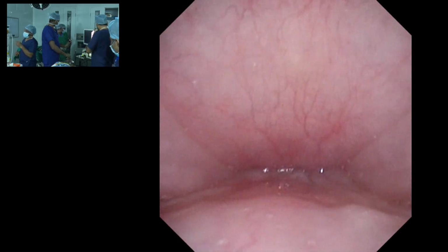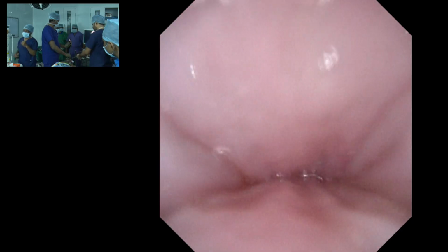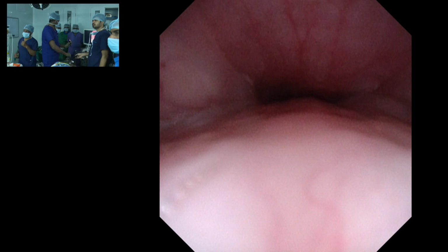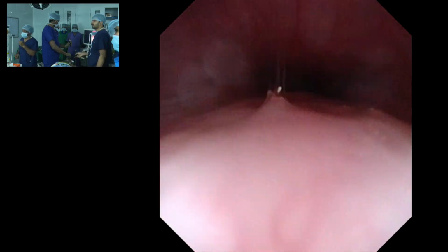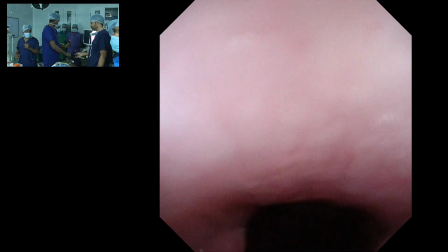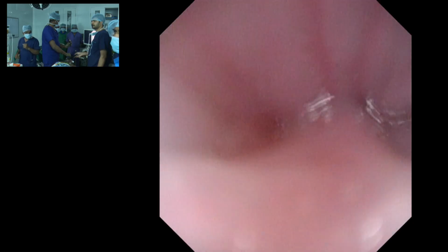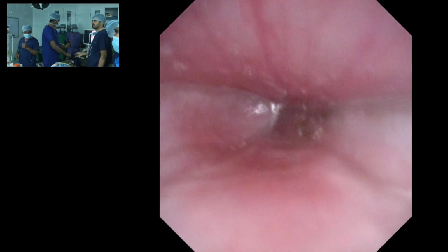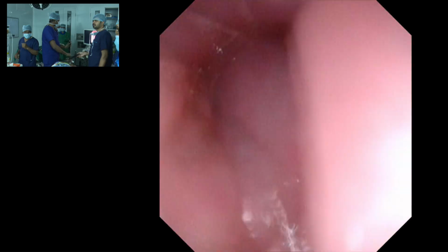So, to put it in a nutshell, the patient is in a supine position. The surgeon is on the right side of the patient. The flexible scope is held with the right hand, passing it through the left nostril, holding the main scope in the left hand and using the knob to navigate the tip of the scope into the nose and then gradually into the nasopharynx. Perfect, sir. So now I am passing through the velum and crossing the velum, and you can see the oropharyngeal collapse.